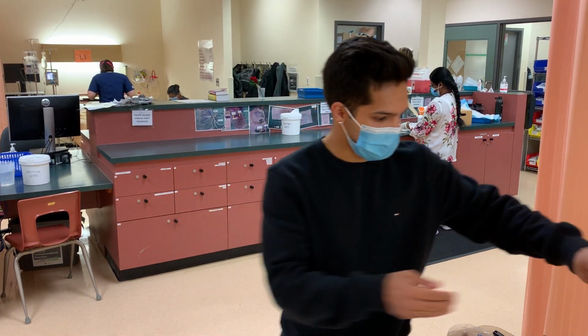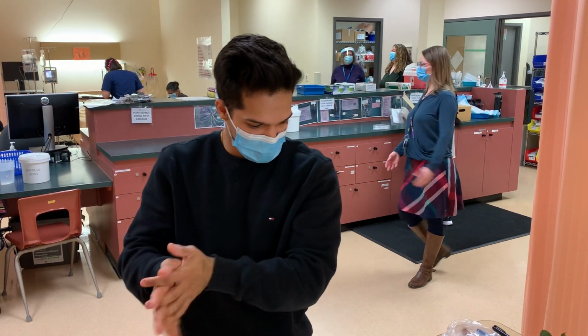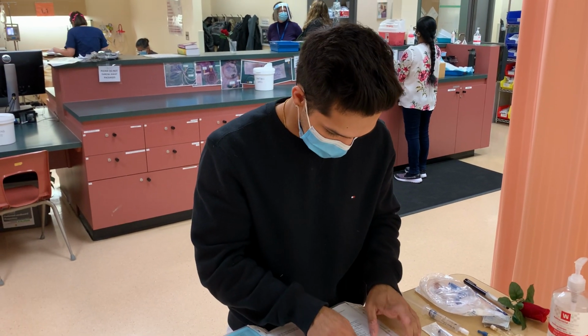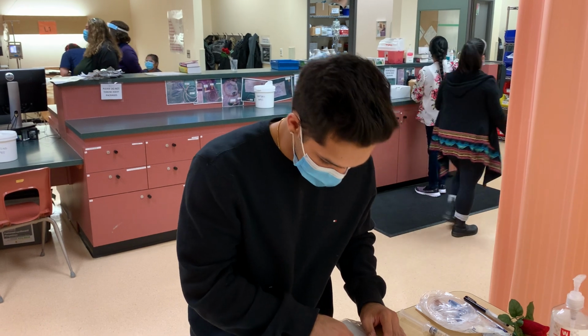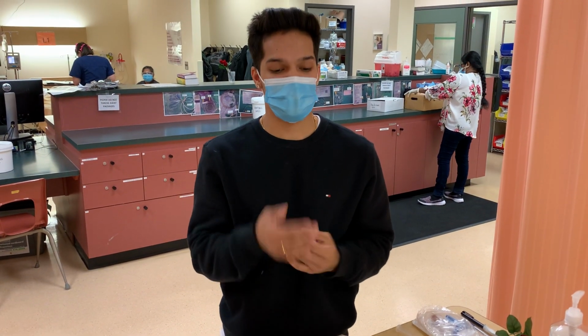Okay, I'll be performing hand hygiene as well. Okay, so the first thing I'm looking at is the PDM for insulin Humulin R, which is exactly what I have, insulin Humulin R. And as I can see, this may be administered by a student nurse such as myself. And for insulin continuous, it is also a high alert medication.